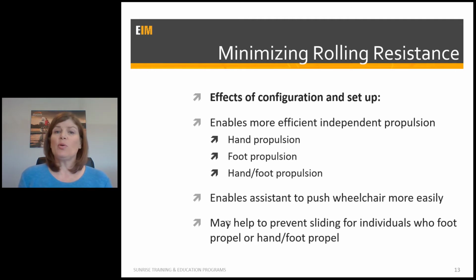And then for an individual who foot propels or hand and foot propels, we can also help to prevent one of the causes of sliding for individuals that propel with that method. And what I mean by this is that because we have to overcome inertia when we are starting that movement of the wheelchair, if we're using our foot to initiate that propulsion, if I have to overcome the rolling resistance in the wheelchair, I might have to really dig on my heel and pull forward to get that wheelchair to start moving.